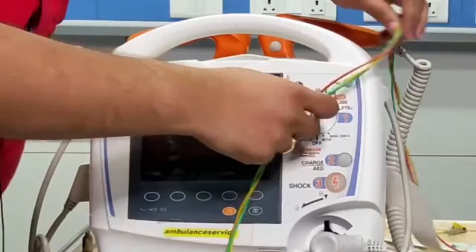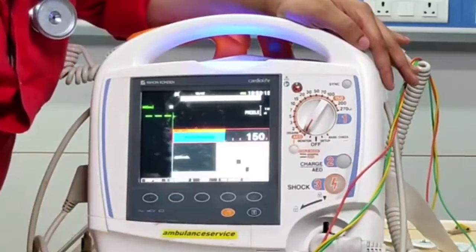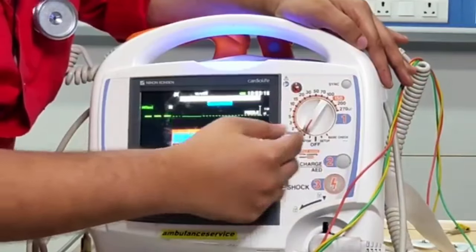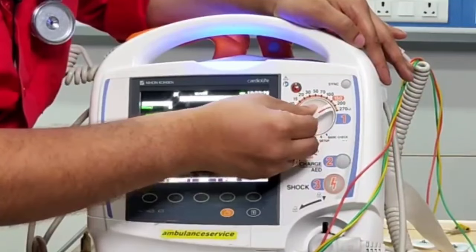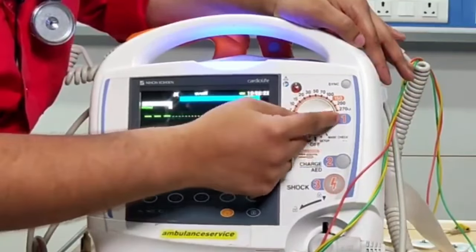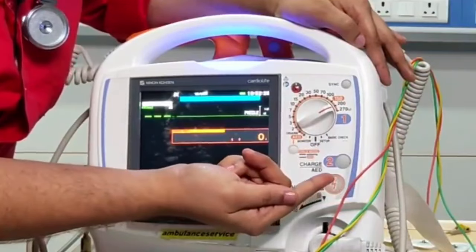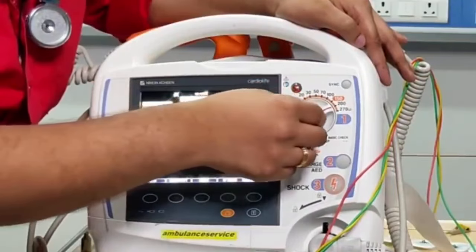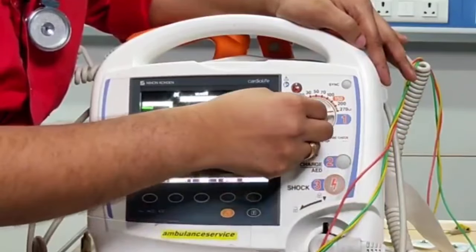And again you can see, I have switched on the machine. Adult mode. Use disposable pads. This is the AED mode that I have switched on. Now I can select the energy. See here, I have selected 270 joules. That is the maximum, or you can start with 200 joules. There is no harm. 200 joules is the recommendation in a biphasic defibrillator, and if you are having any doubt, select the maximum joules, that is 270 joules.